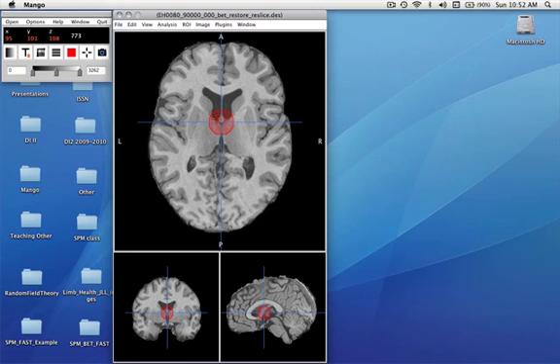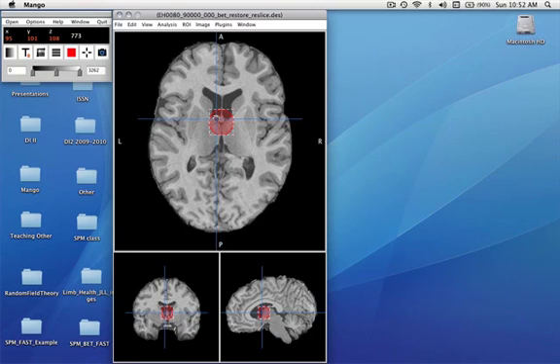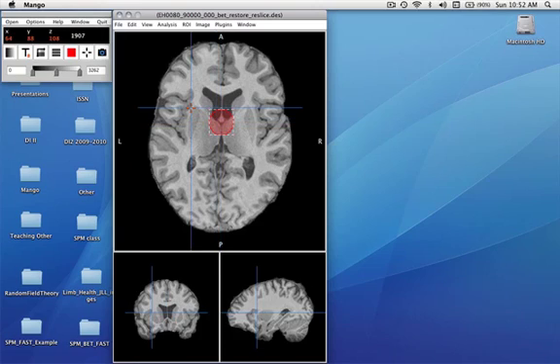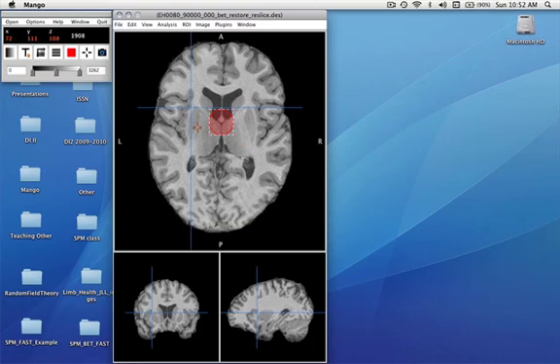You select a region of interest by double-clicking inside it, double-clicking outside deselects it. You can also use Shift and drag to select a region of interest, very much like other graphics programs.